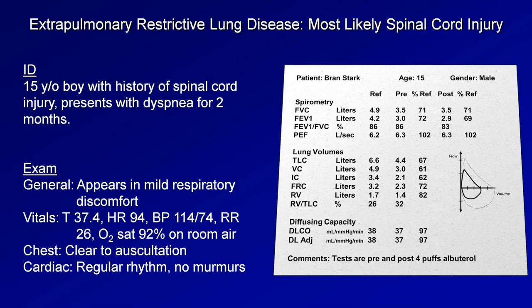An interesting related finding is the combination of the hypoxemia with a normal DLCO. If the DLCO is a measure of the function of the alveolar capillary membrane, and thus a surrogate for gas exchange, and if the DLCO is normal, why would the patient be hypoxemic? The only possible conclusion is that the patient is severely hypoventilating.